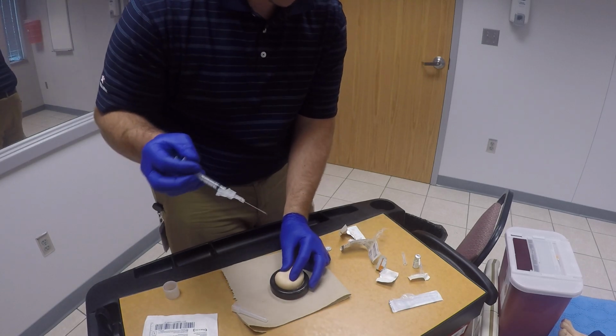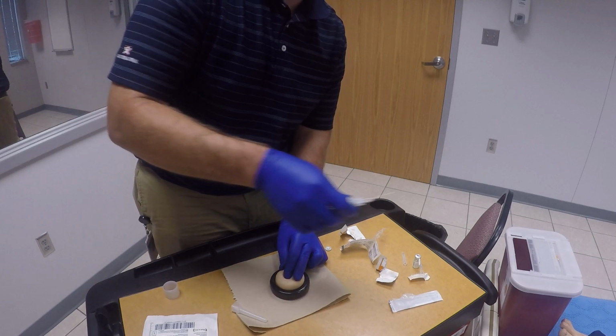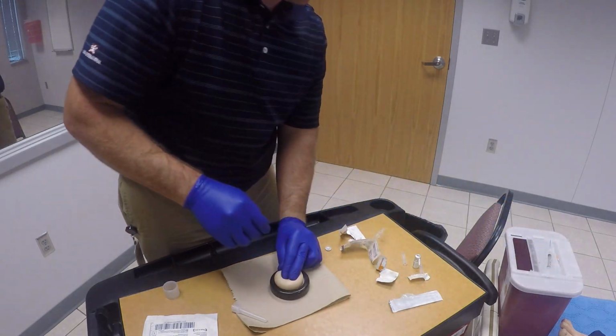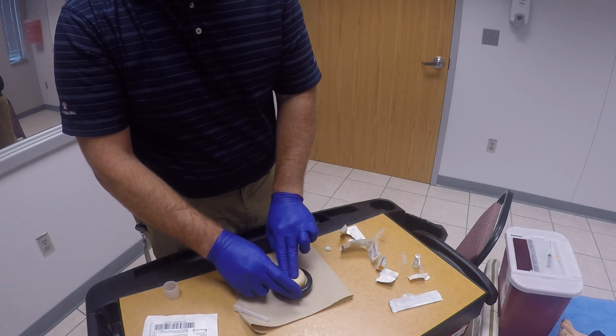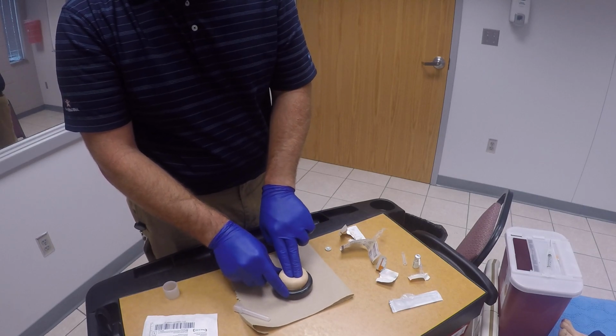Remove it. You can begin to massage that site, and you want to dispose of that in a sharps container immediately. You're going to be applying direct pressure to it, and then you can also help massage it into the muscle there.